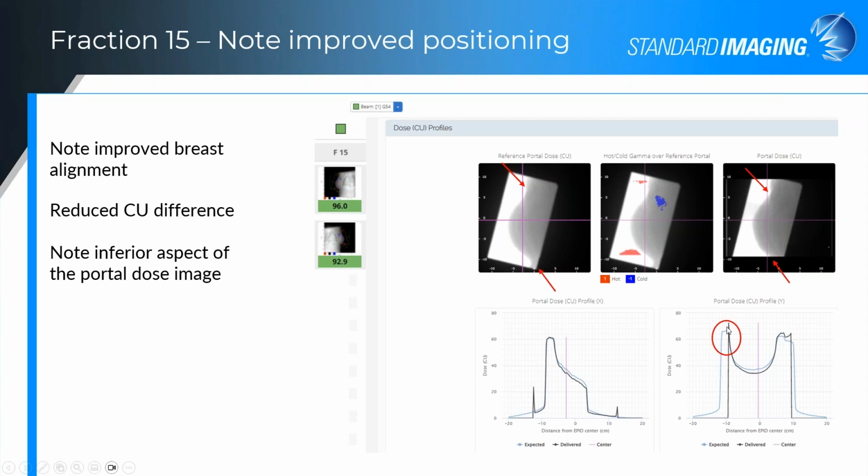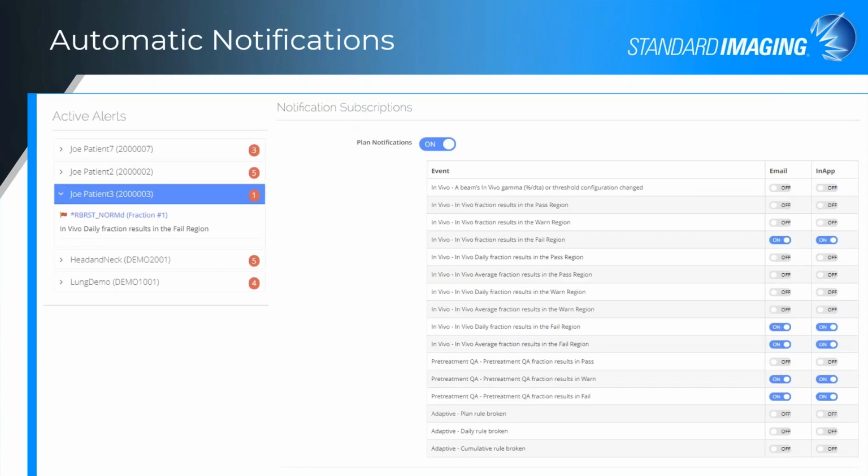So with this signal running a little bit hotter, maybe you could recommend that the therapist move the panel just to catch that inferior aspect a little more, since you've got the top part covered and it's setting up nicely. One of the things that could be done is just to collect a little more on this aspect of the treatment portal. So it would be just moving that panel just a bit inferiorly, if that makes sense. But overall, nice change with the corrections that they made.